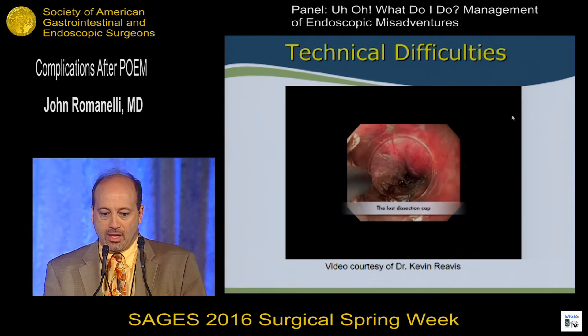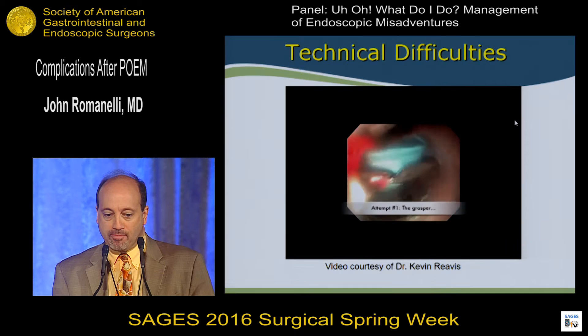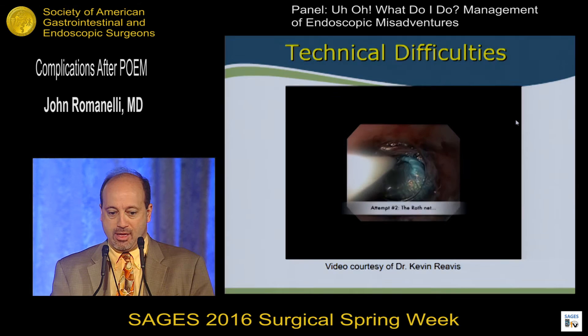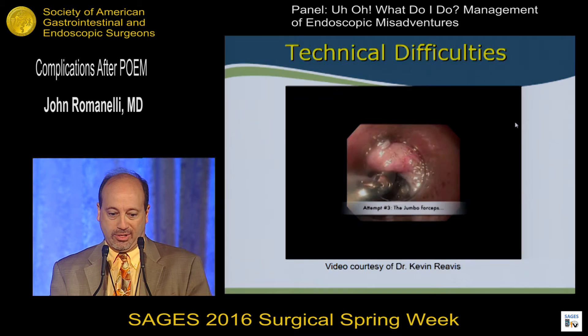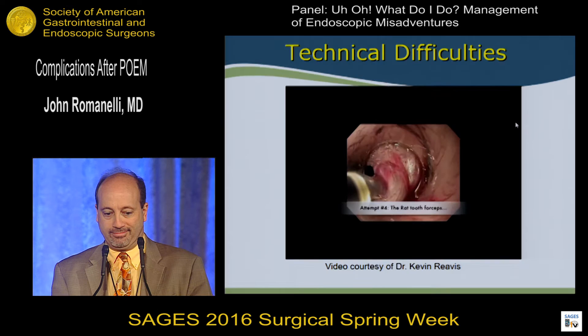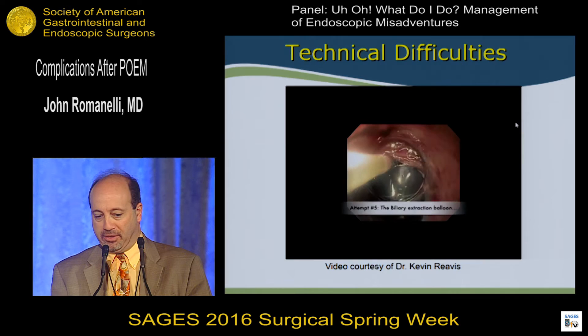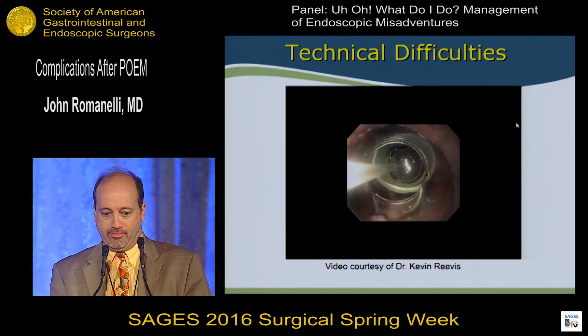Sometimes technical mishaps can ensue. In a case that Dr. Swanserman and Revis were doing, the cap became dislodged from the endoscope. They first tried to grasp it, but it was too big. Creatively, they tried passing a Roth net — that didn't work. They went to the jumbo forceps — that didn't work. They tried rat-tooth forceps — almost grabbed it, but not quite. Finally, they used the biliary extraction balloon, going distal to the cap, inflated the balloon, and pulled the cap back toward the scope to retrieve it. That beautiful one-and-a-half-minute video took about an hour and a half of ingenuity.